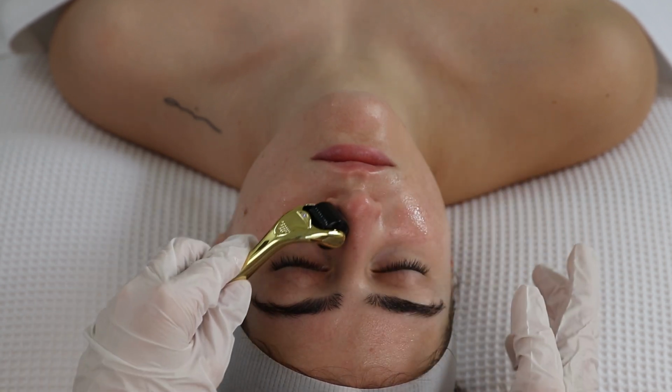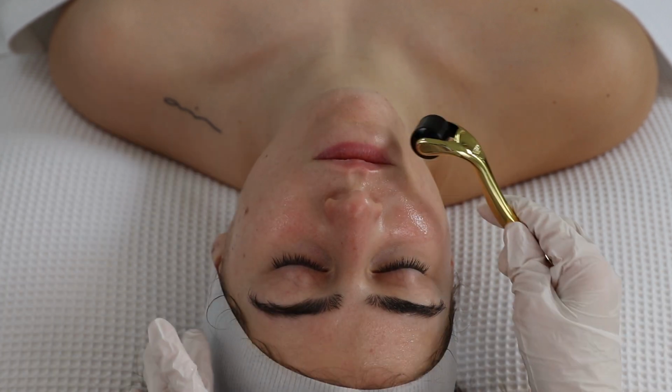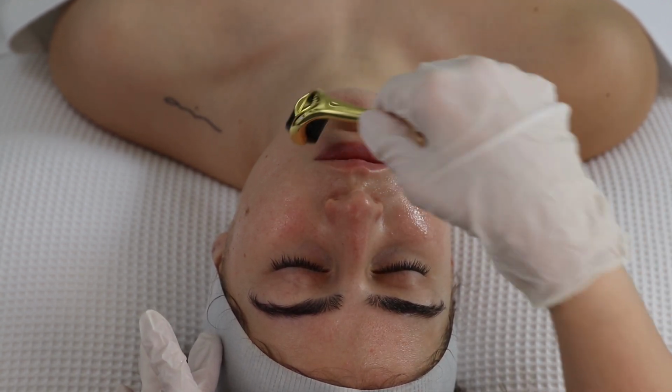When you've covered all areas, throw the dermal roller away into a sharps bin, or alternatively you can put it back in its plastic container and give it to the client to use from home. Once you have carried out the dermal roller, you can move on to removing the chemical peel.